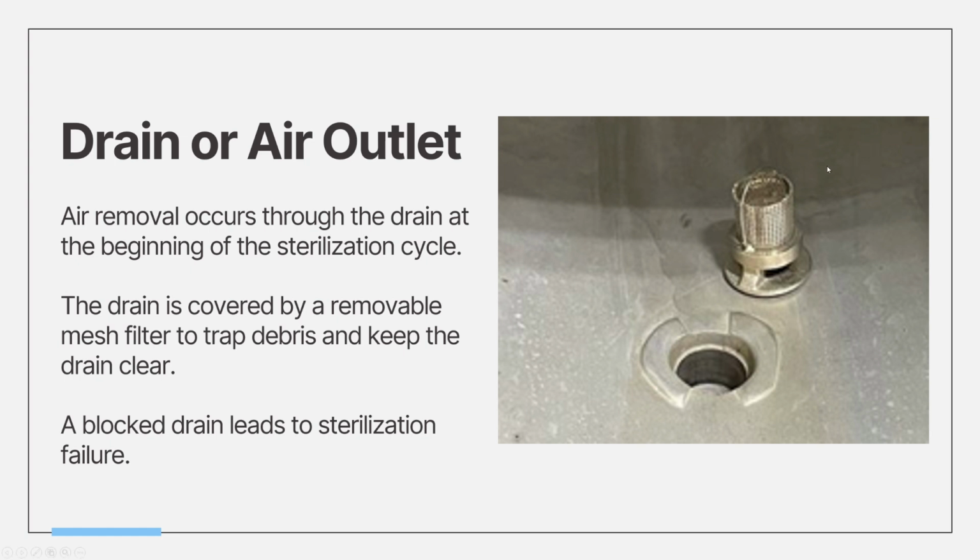Some hospitals actually keep extras and rotate them out, so that after this was used for the day, let's say at night, the night shift would put it through decontamination, treating it like an instrument where you would brush it, clean it properly, and put it through the washer disinfector. And obviously you have to wait for it to completely dry, because if you were to put it in there while it's still soaked, it could actually compromise the sterilization cycle.